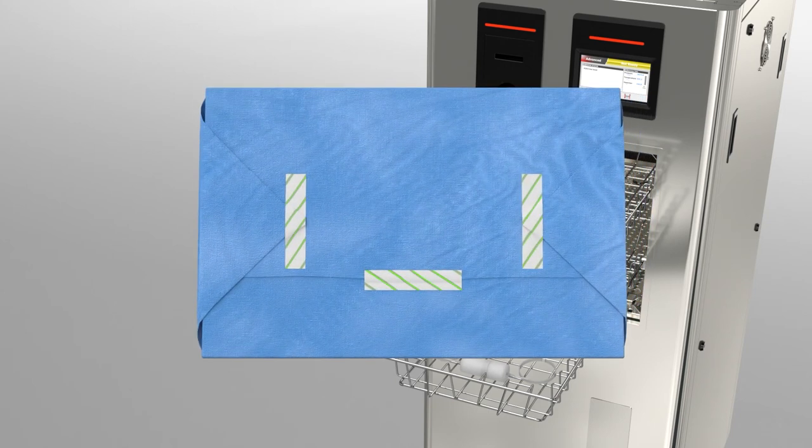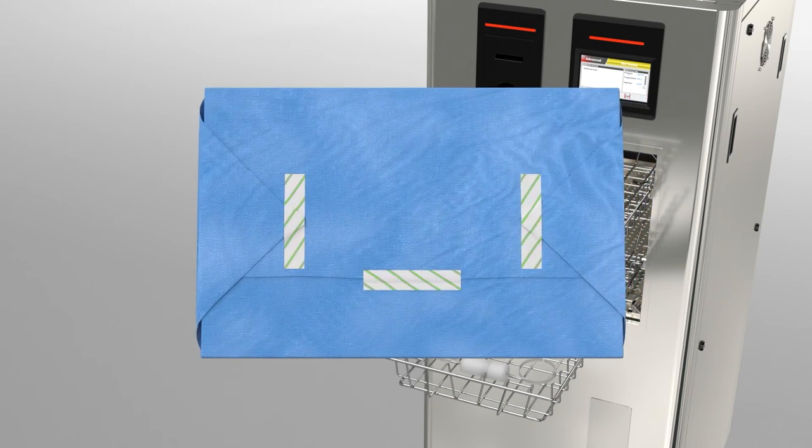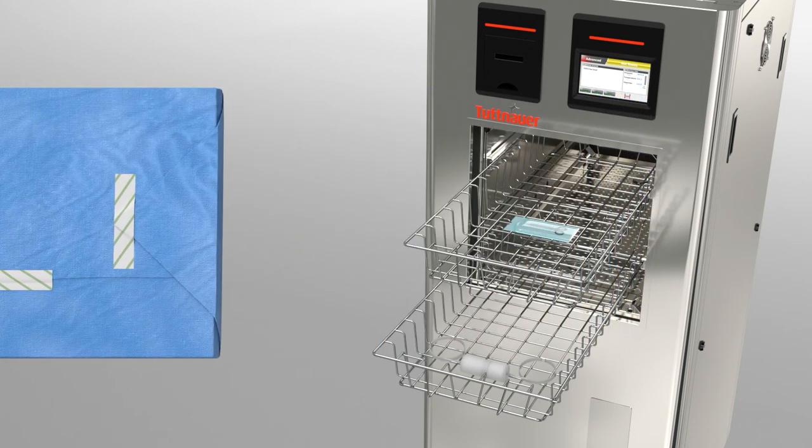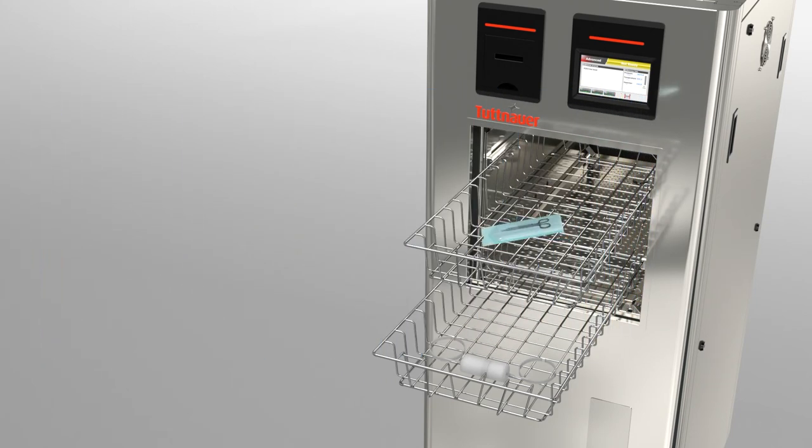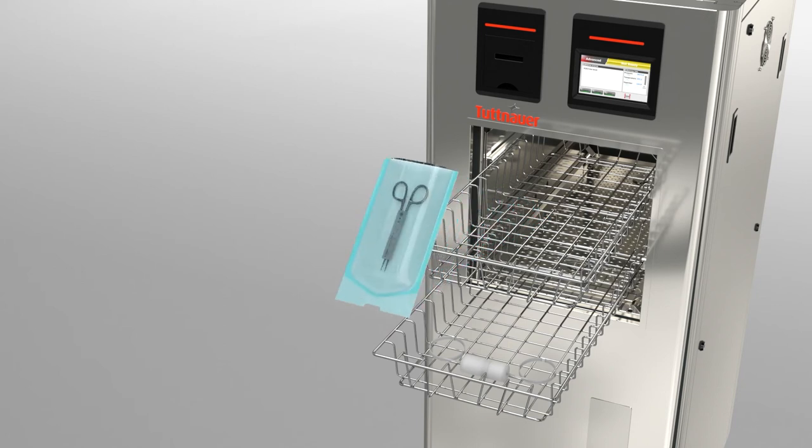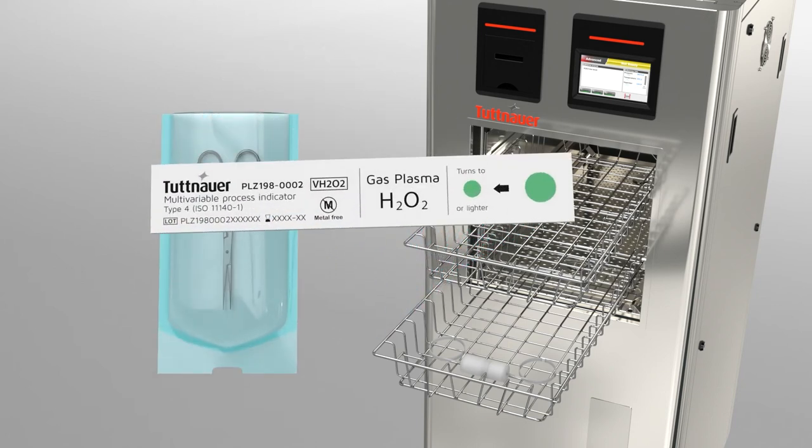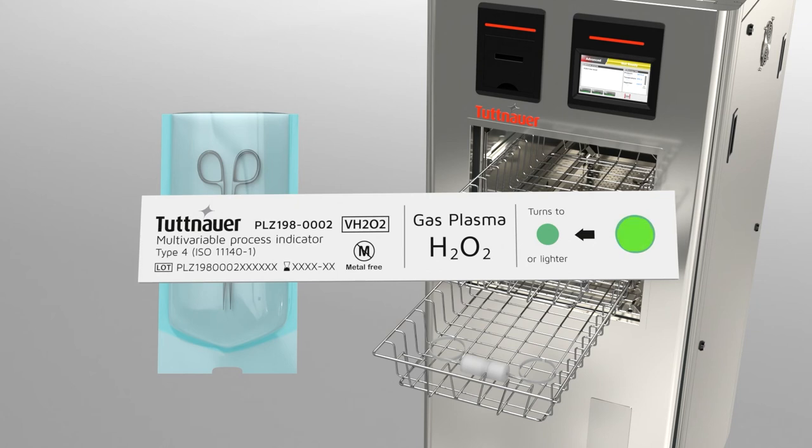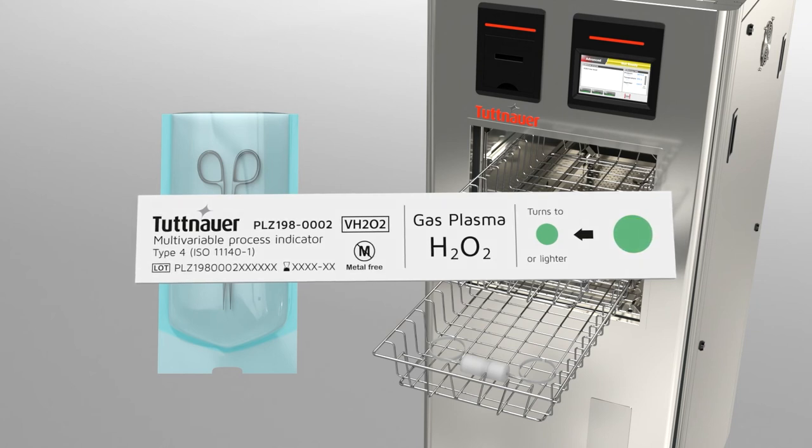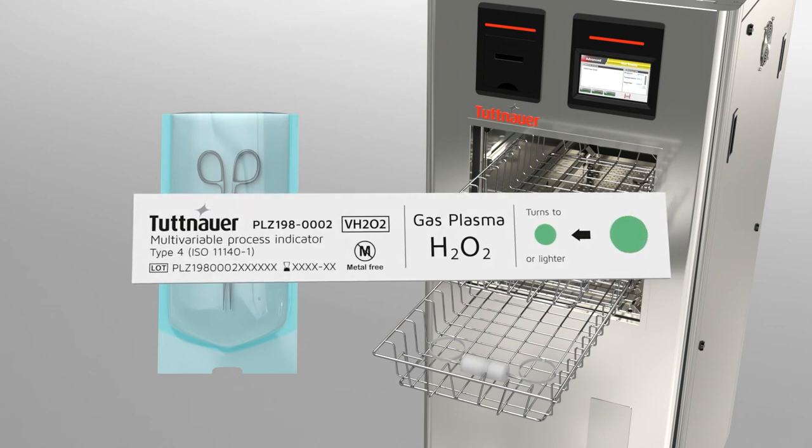The stripes of the indicator tape change their color to indicate an effective sterilization process. A unique point indicator on the chemical indicator strip assures exposure to the stated values of critical process variables.